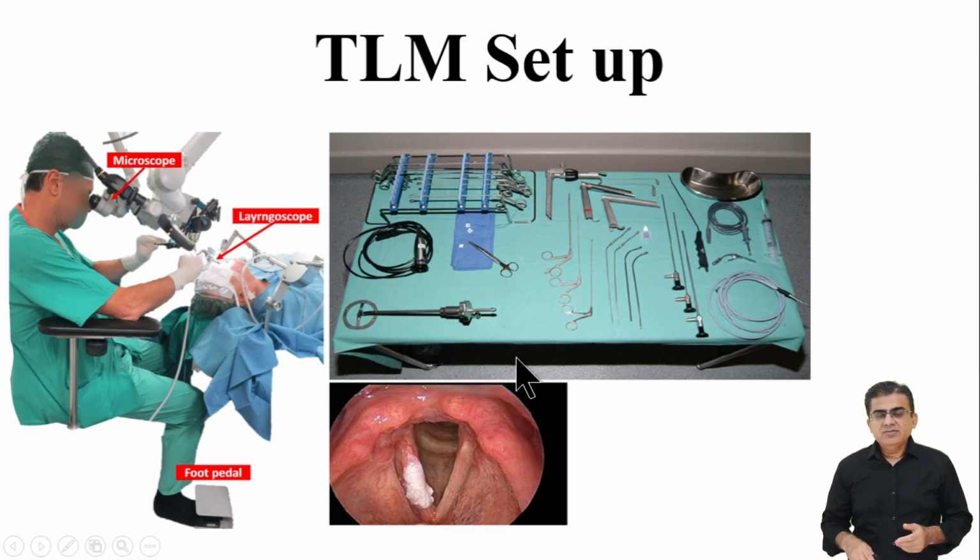Now look at the left side of the screen again. Notice the foot pedal placed near the surgeon's foot. The surgeon presses this pedal to actually fire the laser beam.